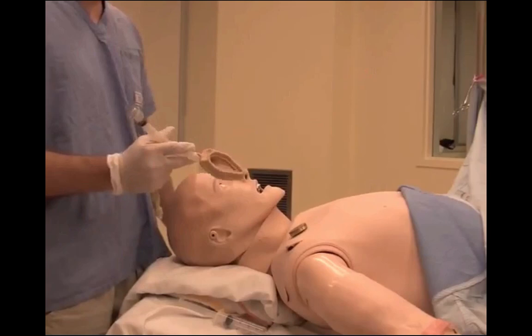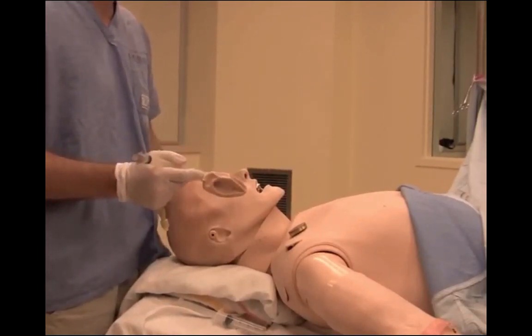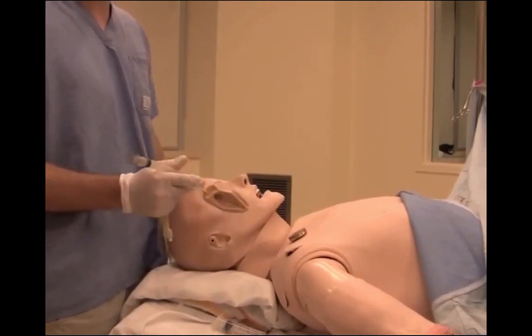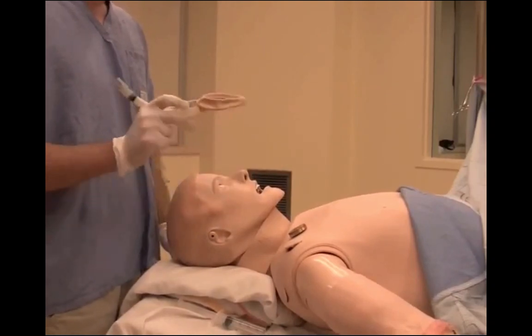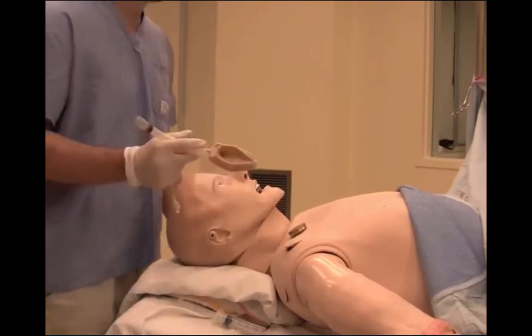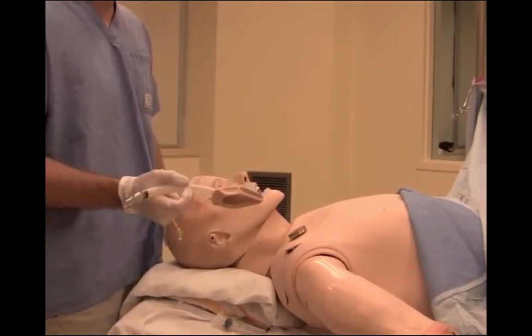The LMA was introduced approximately around 1990 by Dr. Archie Brain, and has since revolutionized airway management, both in elective and in emergency situations. Insertion of an LMA can be done by both skilled and less skilled operators; however, there are several technical aspects that need to be covered.